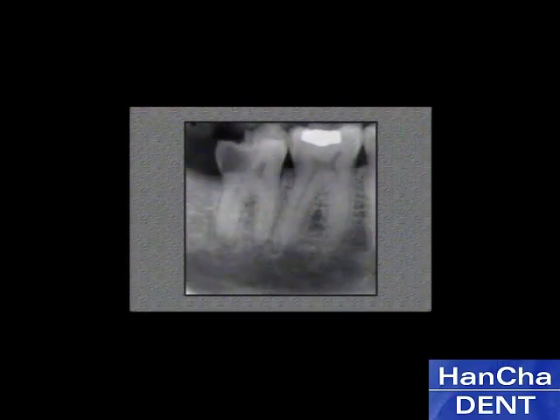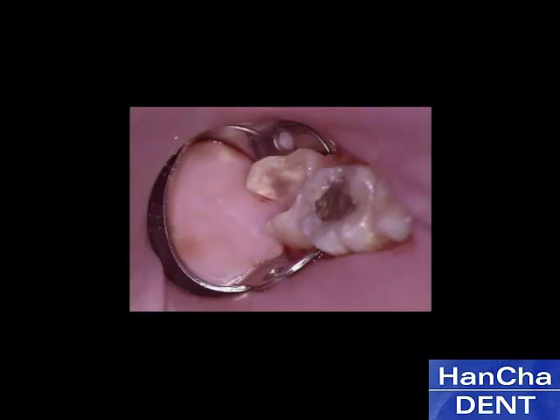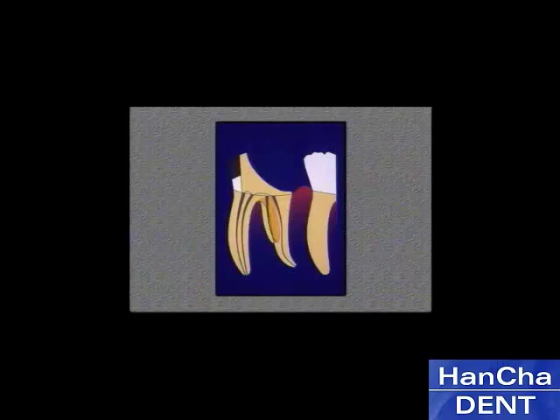The orifice of the root canal lies on the floor of the pulp chamber, deep within the coronal structures of the tooth. Visual and physical access to the orifice is obstructed by those coronal structures and by prominent marginal ridges of adjacent teeth. Often, endodontic procedures are complicated by severe coronal breakdown, which compromises the ability to obtain ideal isolation.